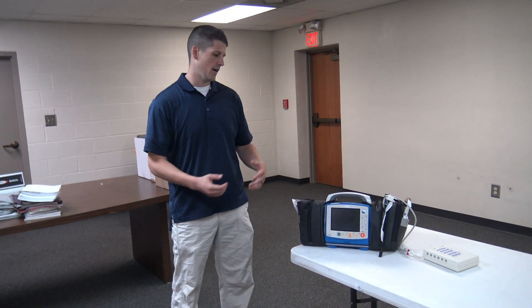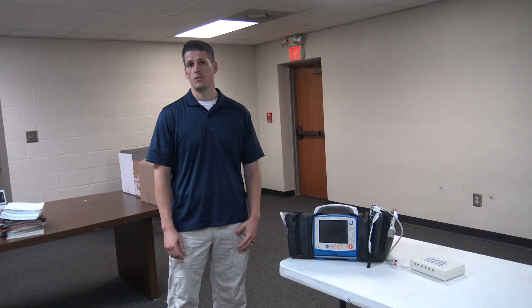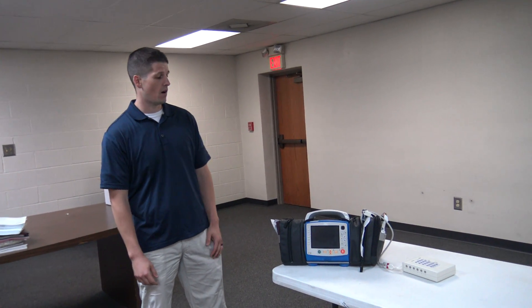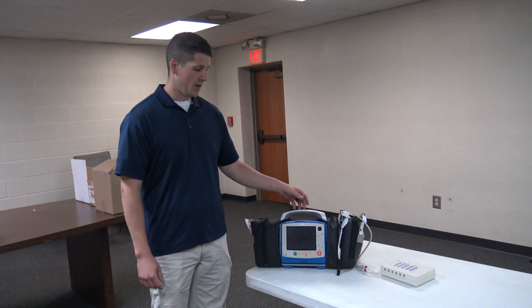We're just going to do a quick review today on how to deploy the X-Series Zoll Monitor as an AED, as we've been practicing in the pit crew CPR classes. Not everybody got a chance to get to those classes, so hopefully this will bring you up to speed.